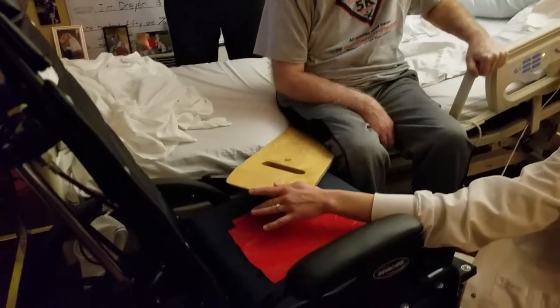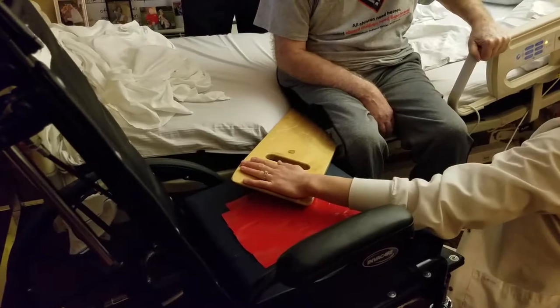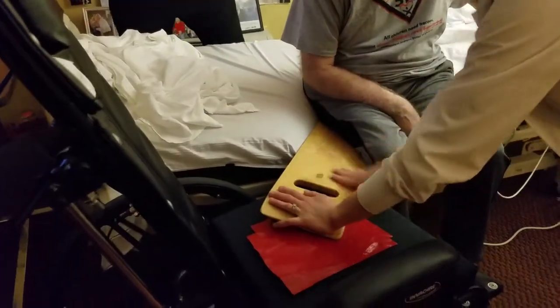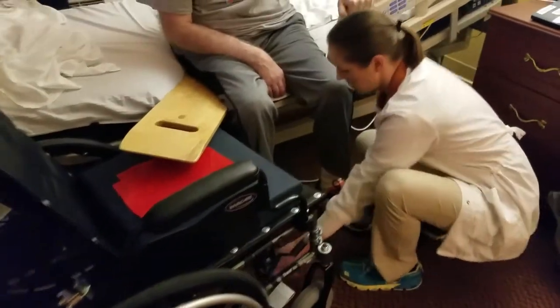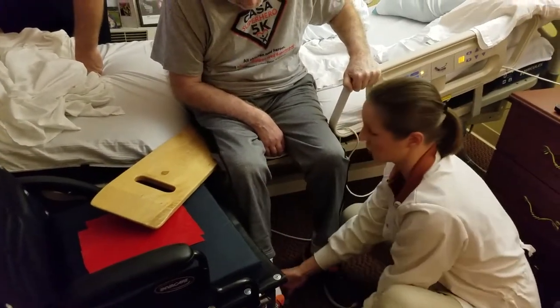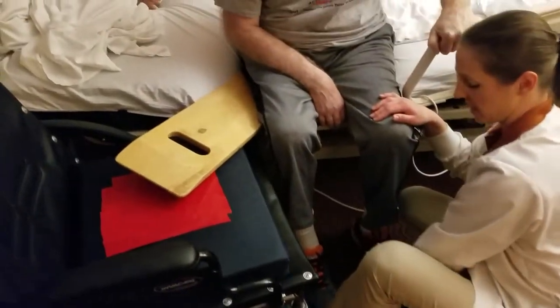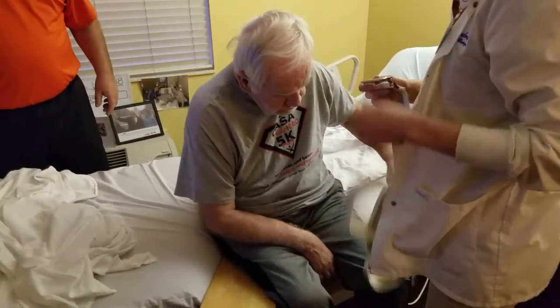It would actually be better to go up there, so I'm going to raise you up. You don't want it to be a steep hill either — that should be good. His feet need to be here and here; they shouldn't be too far back or too far out. If you can angle that footrest, it's hard to keep in place but that would be better — you can put your foot there to help keep it.